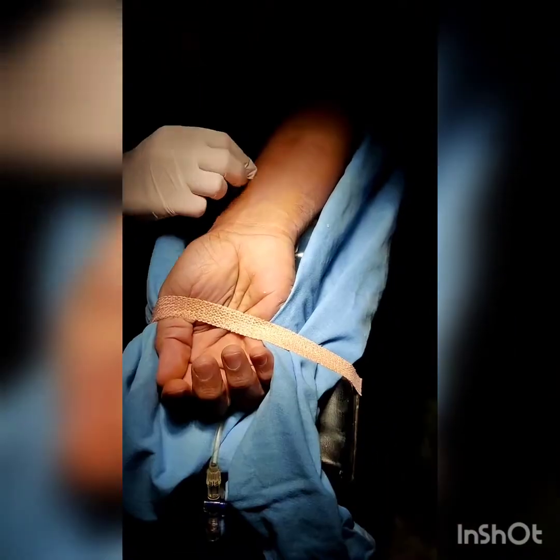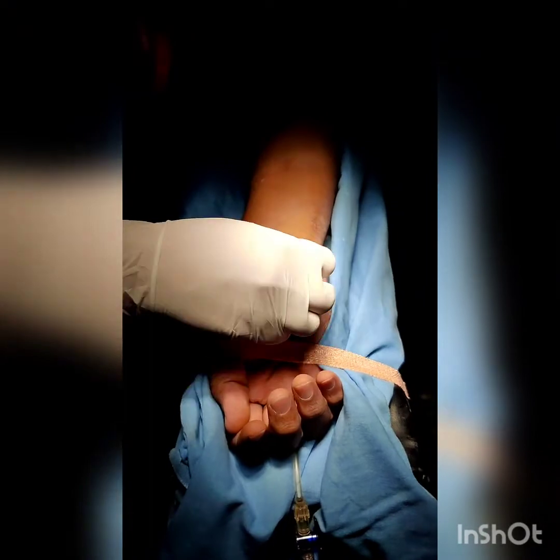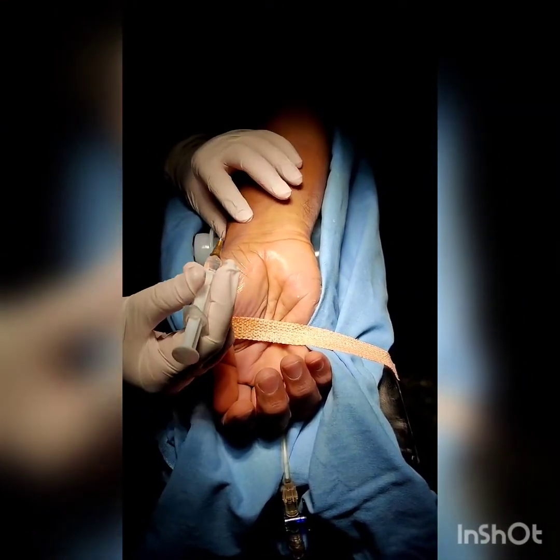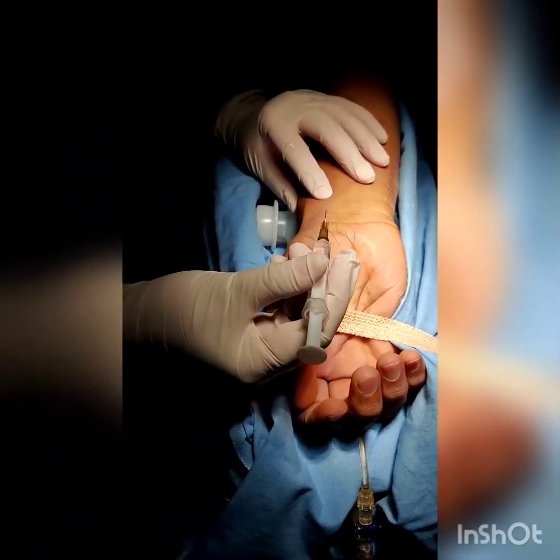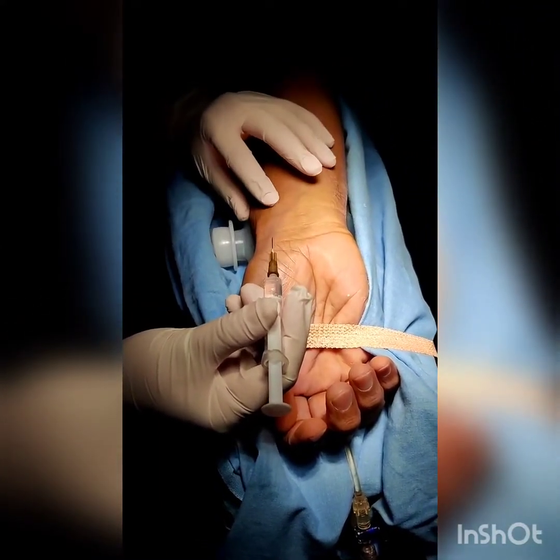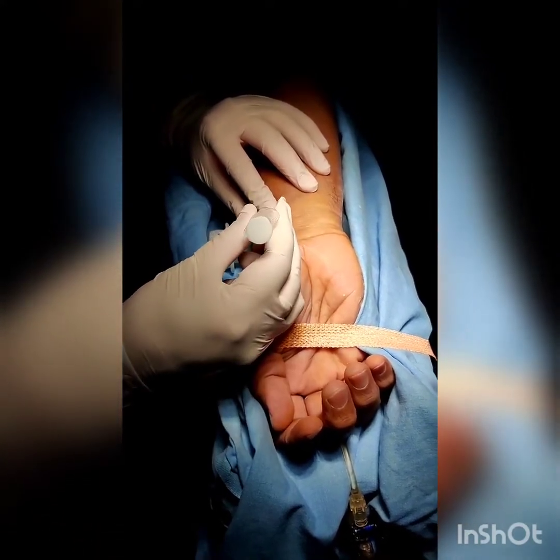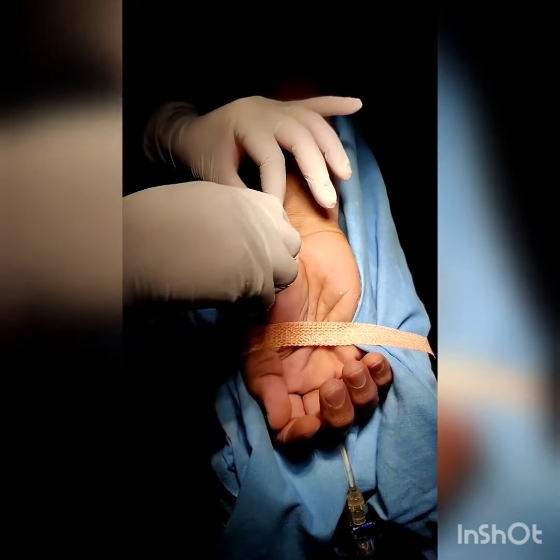Clean the area with spirit or 2% chlorhexidine. Using surface landmarks, palpate the radial artery around 2cm proximal to the wrist crease. Give local anesthesia if the patient is awake, using a short length 26-gauge needle by injecting not more than 0.3 to 0.5ml of 2% lignocaine. Keep the injection superficial.